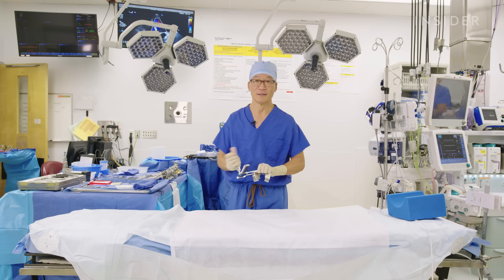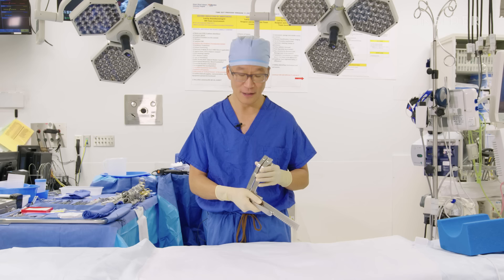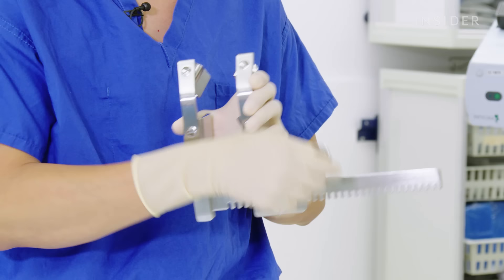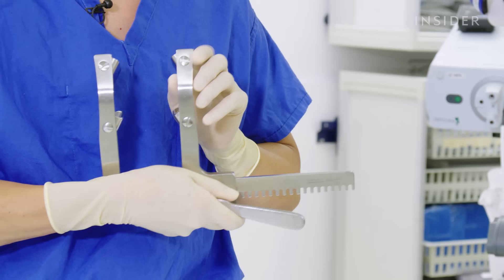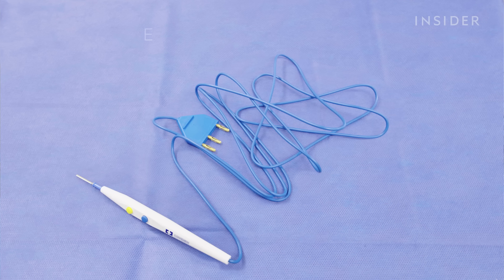That sound gives me a very visceral reaction. Years of training. This is the Morse sternal retractor, and this is what we use to hold the breastbone open. It gets inserted something like this, and then we can retract the sternum, which then will give us access to the heart.